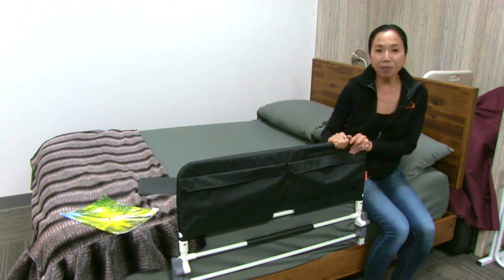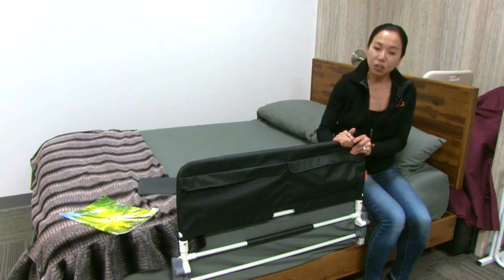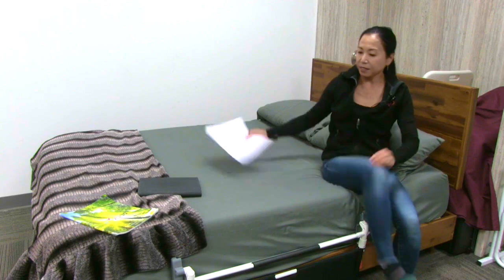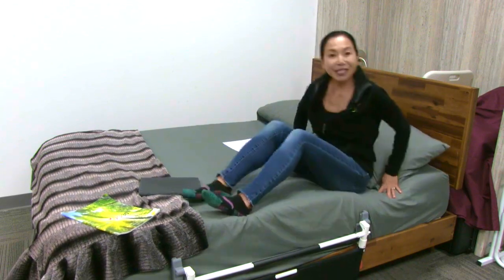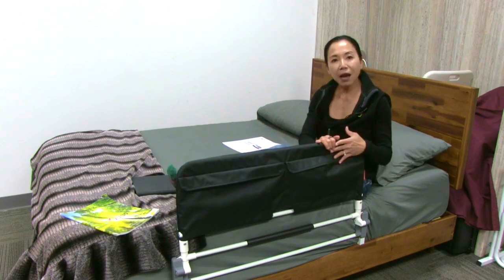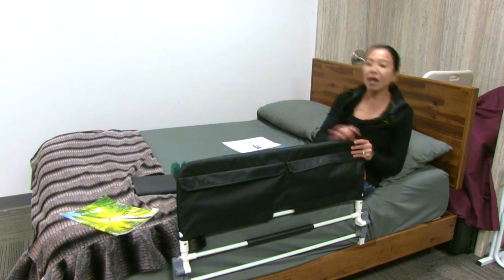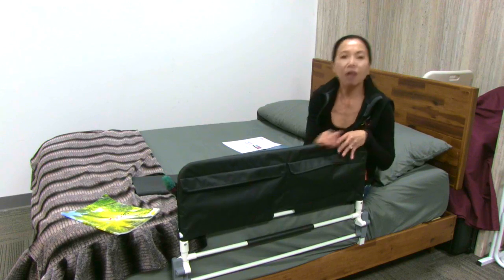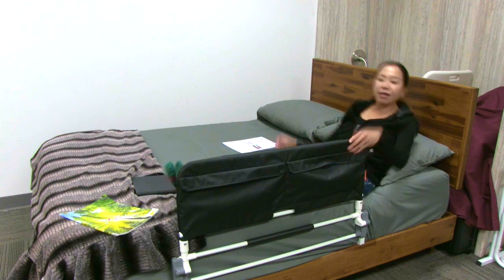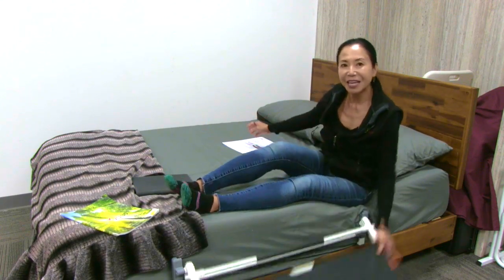Using the bed rail is great because it helps the user get in and out of bed as a support rail, and then it's a great safety embrace rail. You simply pull it up and now your loved one, the user, is safely in bed and this bed rail protects them from an accidental fall or roll out of bed. Then it's so easy to fold it back down to get in and out of bed.